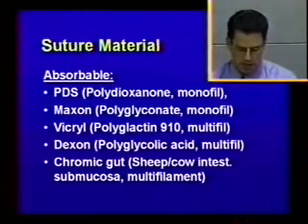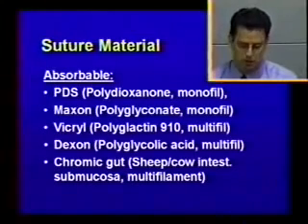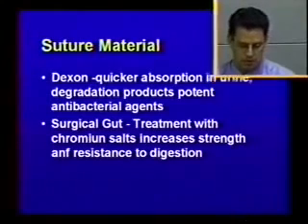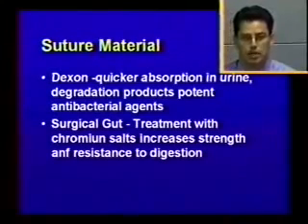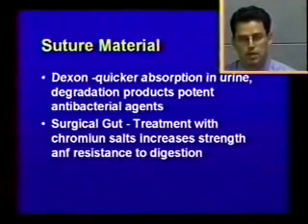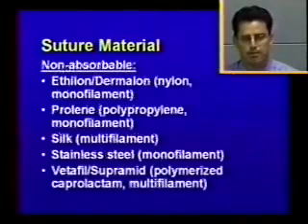And Dexon, polyglycolic acid, a multifilament absorbable suture material. And then finally, chromic gut. This is made out of sheep or cattle small intestinal submucosa, and this is also a multifilament suture. Specifically, Dexon has been shown to have quicker absorption time in urine, and degradation products have been shown to have potent antibacterial effects. Surgical gut treatment with chromic salts increases the strength and resistance to digestion, and the concentration of the salts will dictate how much it does so.